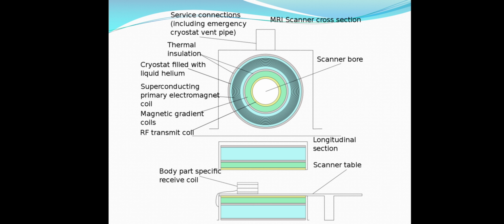The atoms are excited by a radio frequency pulse, and the resultant signal is measured by a receiving coil. The RF signal might be processed to deduce position information by looking at the changes in RF level and phase caused by varying the local magnetic field using gradient coils.